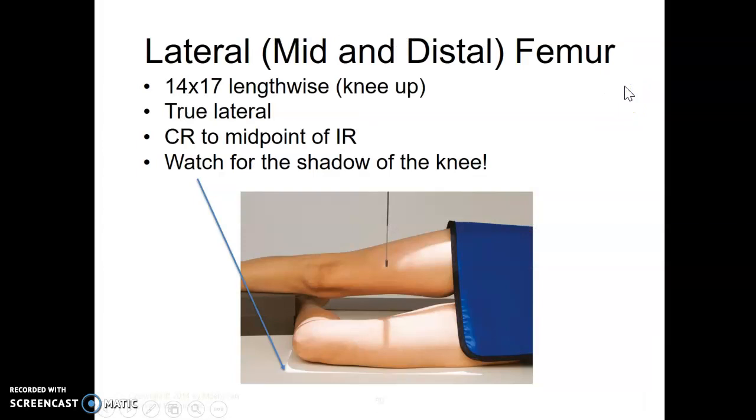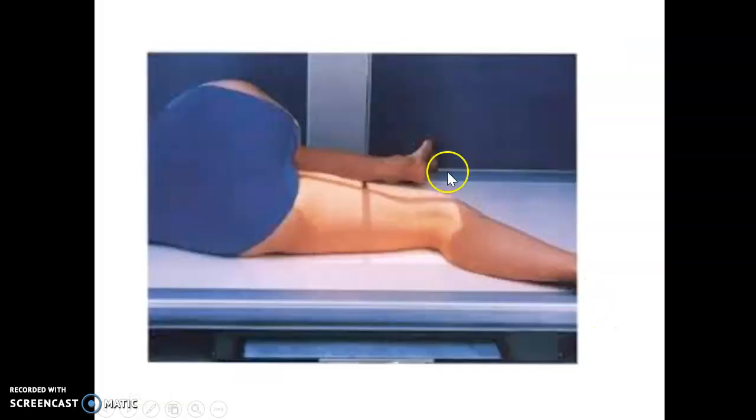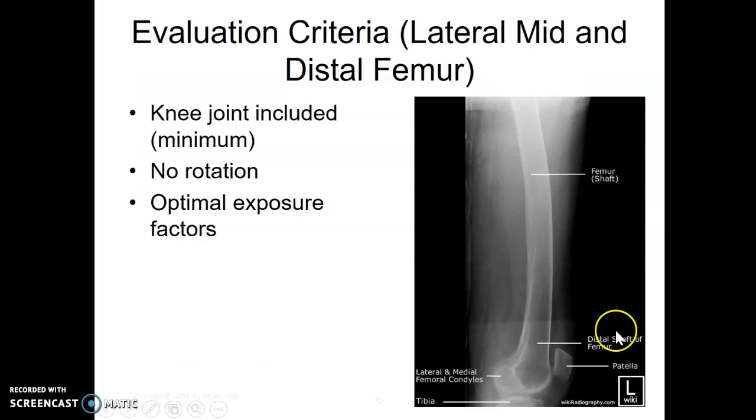For the lateral knee up, set the patient up similar to a lateral knee. Turn them on the affected side and bring the other leg up in front with the same bend of the knee. Watch your shadow of light, make sure the bottom of the knee is on and get as far up as you can. Ideally you have from knee up in lateral position as far as you can.